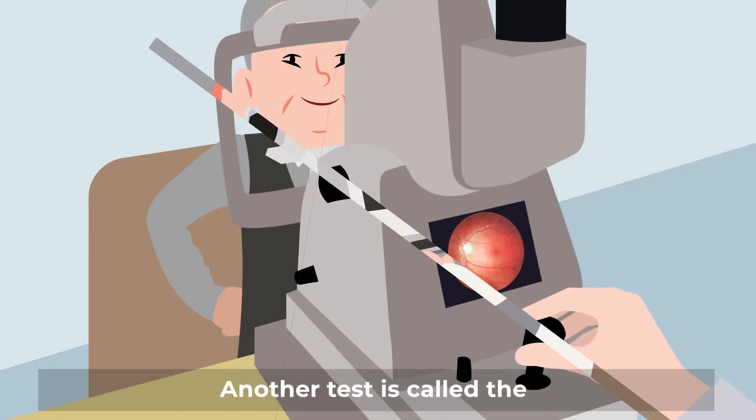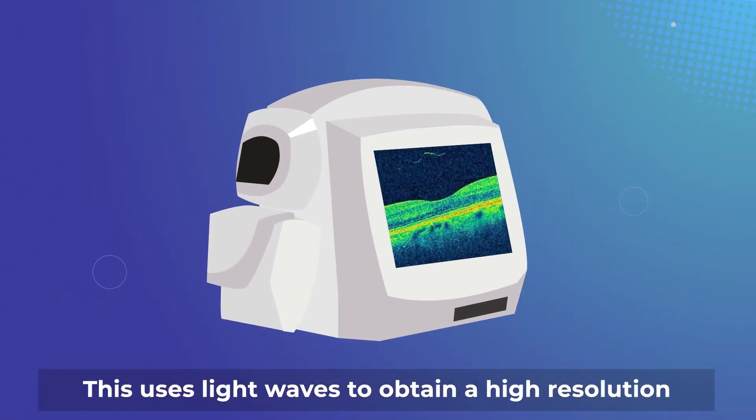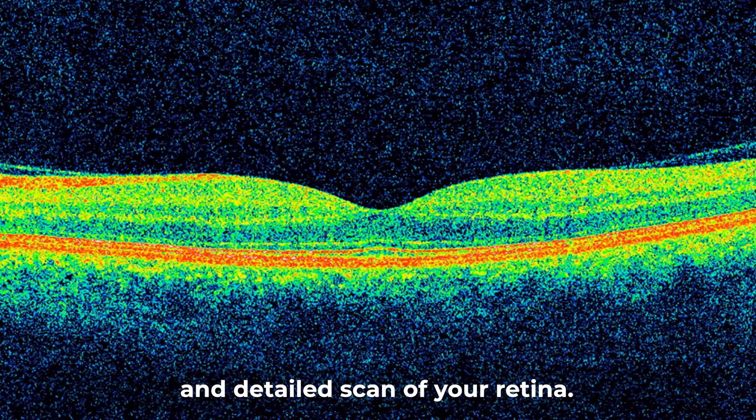Another test is called the Optical Coherence Tomography, or OCT for short. This uses light waves to obtain a high-resolution and detailed scan of your retina.